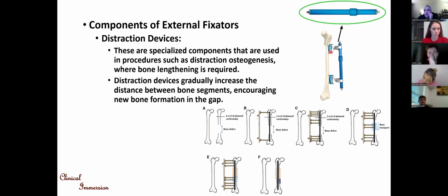So the osteotomy we perform here will gradually widen and increase the length of the limb. And as this osteotomy is separated, the new bone formation, which we call distraction osteogenesis, forms here, and the defect will be filled. This is the basis for limb lengthening in orthopedic surgery. Today we have some other devices that are inserted into the medulla. We will discuss them when we reach the intramedullary nail. They can be used for this lengthening, but they are not as effective as this external fixator.